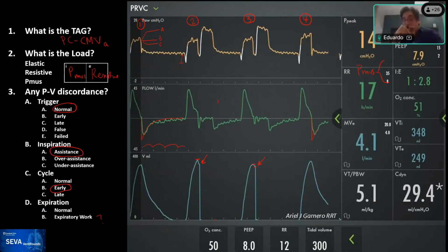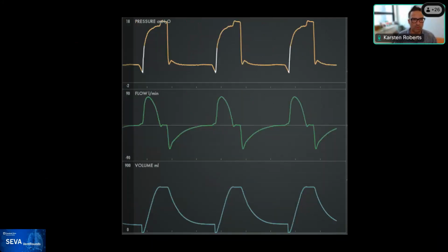All right. Just go ahead. Oh, I was going to say, in the interest of time, we're going to show another waveform that we've seen before. Did you want to review this? No, go for it. Okay.